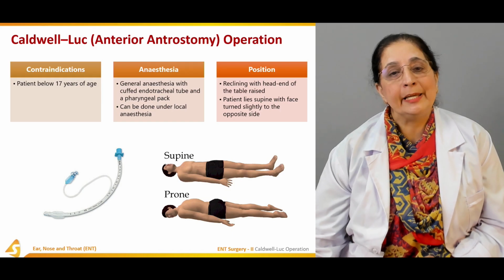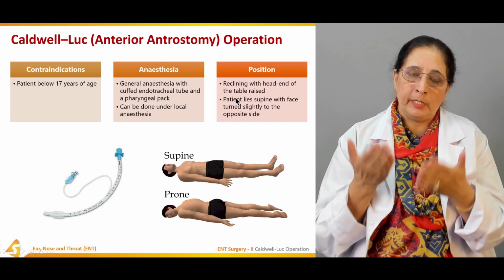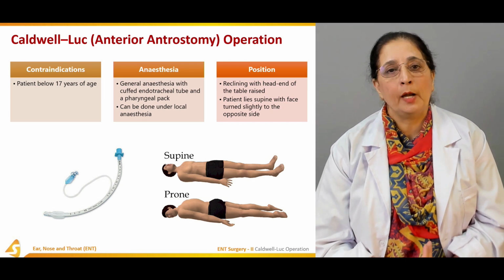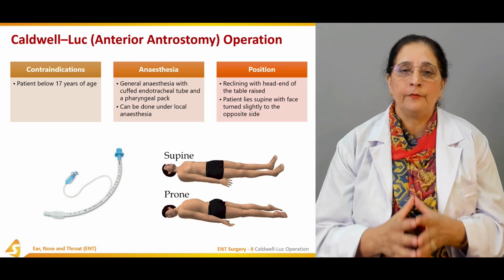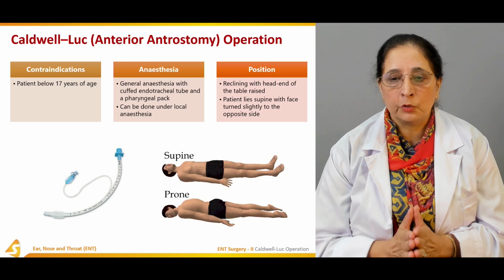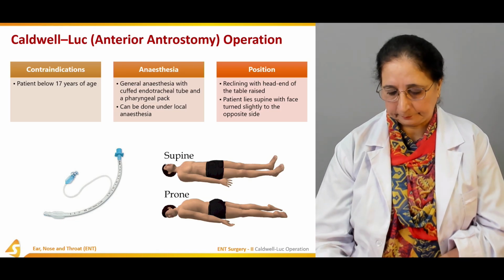Position is reclining with the head end of the table raised. The patient lies supine with the face slightly turned to the opposite side.